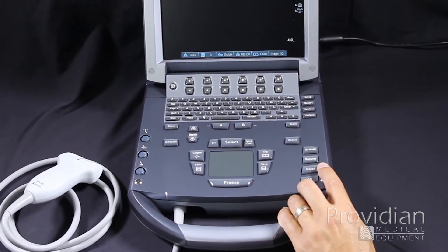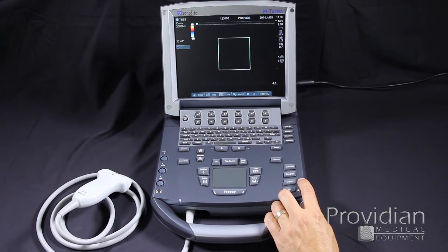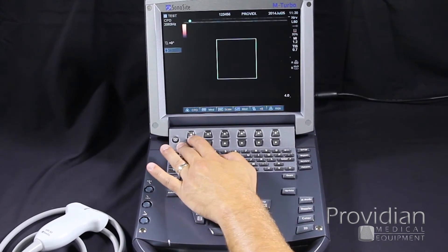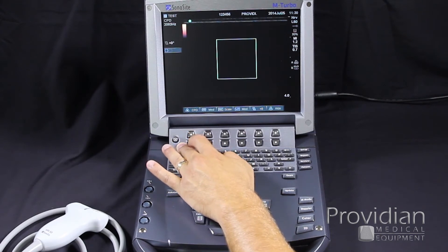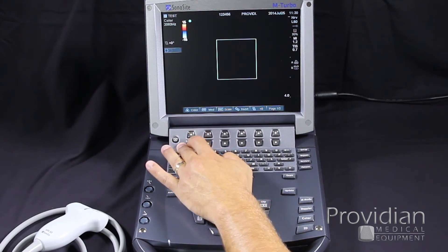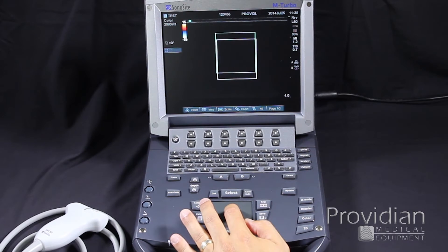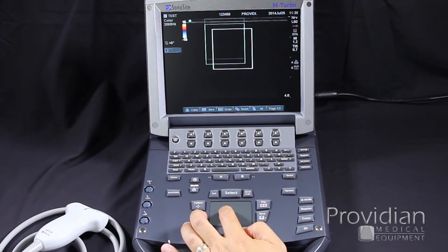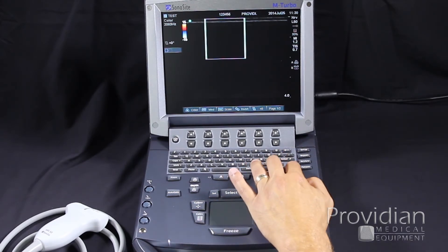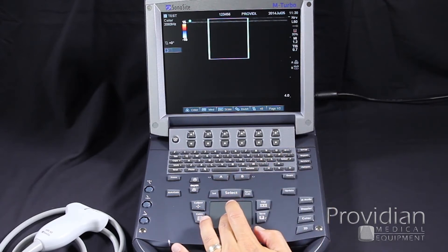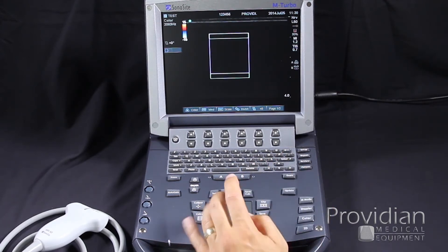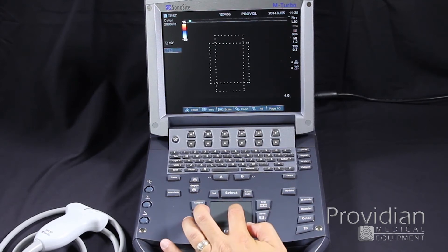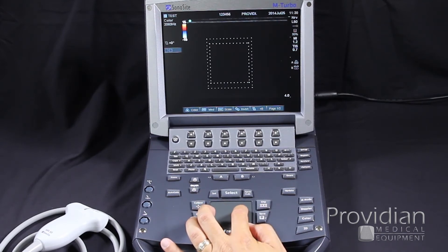We enter color by pressing the color button. It's going to give me an option: do I want color, or do I want color power Doppler, also known as Angio? We'll start with color. We get our region of interest box that we can move by scrolling with the trackpad. You can also use the arrow keys to move it from side to side. If we want to change the size of the box, we click the select key and then use the trackpad to adjust the size.